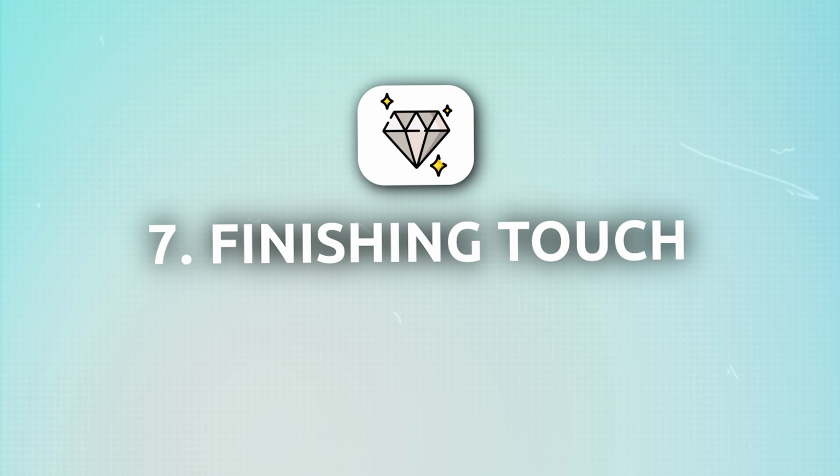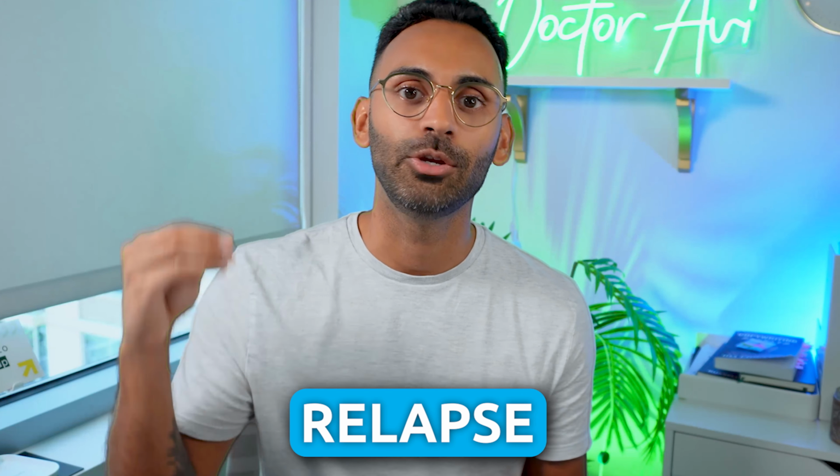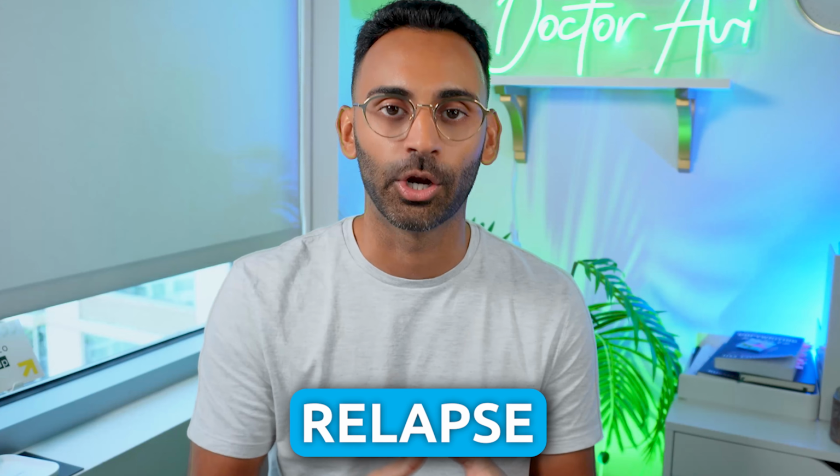Now, if you get something new, which you waited for an entire year, would you want that to last a short period of time or a long period of time? This brings in piece 7, which is the finishing touch. So you've gotten to your goal, everything looks great, everything feels great, your mouth is cleaner, your teeth are straighter, you're smiling bigger, everything is awesome, but your teeth are still moving. You have to protect against the number one thing, which is called relapse. And you do this by wearing your retainer for life. This is gonna help you keep this beautiful smile that you have. This is probably the most important step.